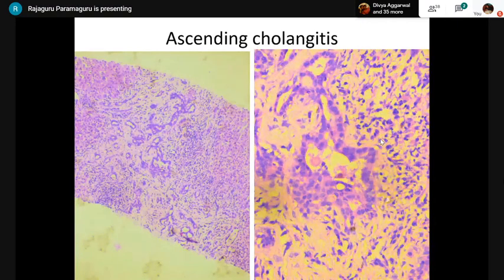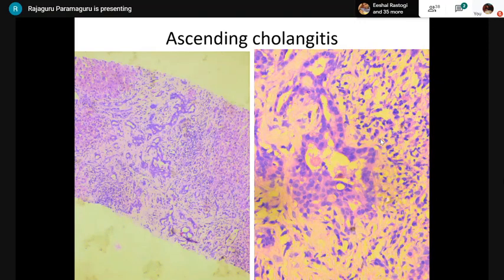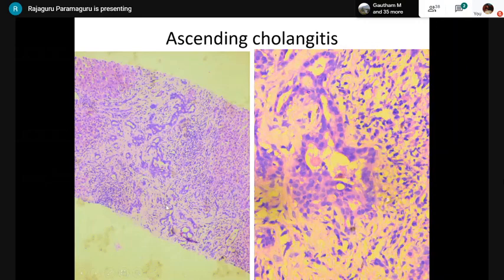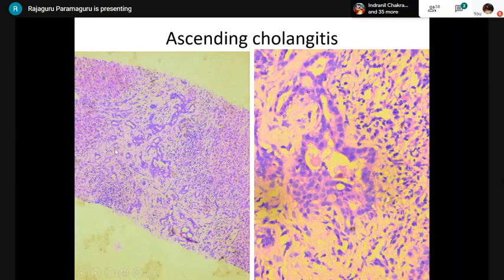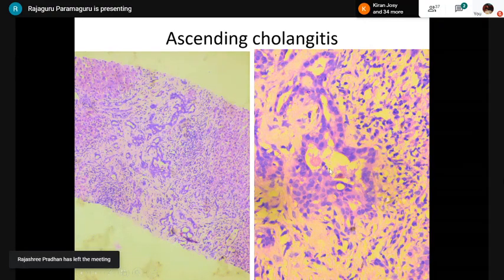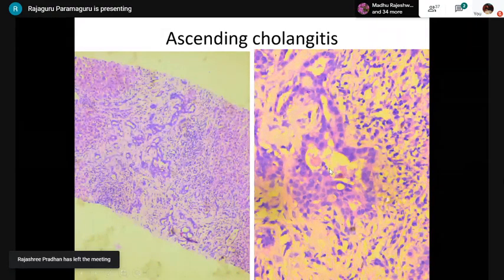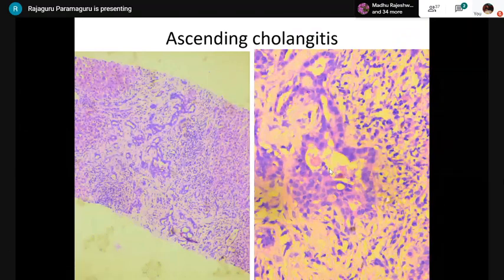Ascending cholangitis: neutrophils within the bile ductules indicate biliary tree infection. In this case, we saw many neutrophils with expansion of the portal tract. The pale staining of the portal tract represents edema — not fibrosis. Neutrophils entering the ductular structures gives the impression of ascending cholangitis; if not, you have to consider large duct obstruction.